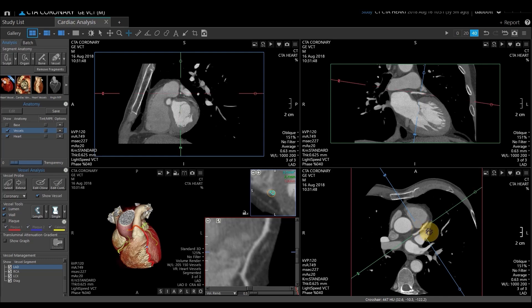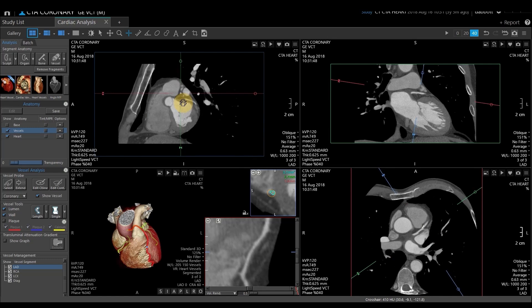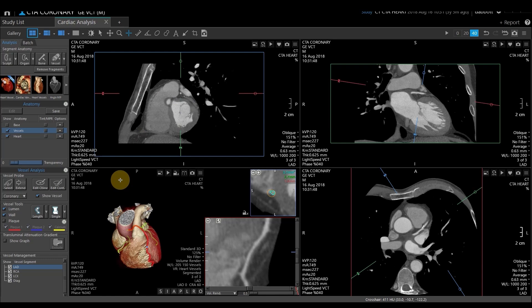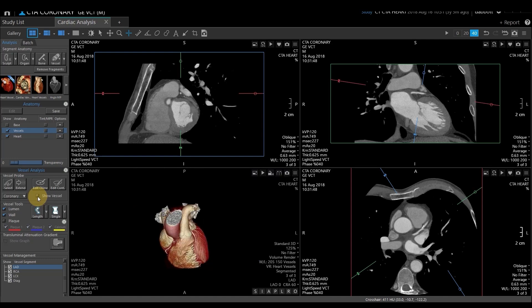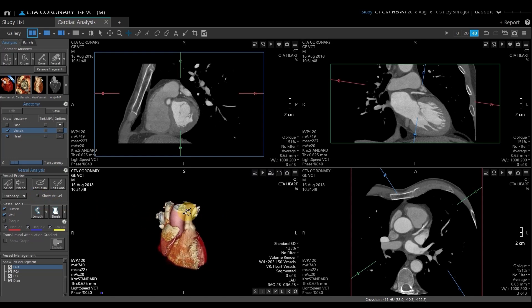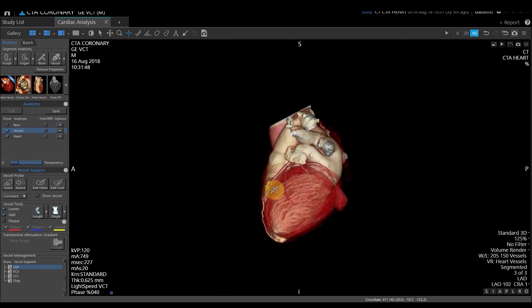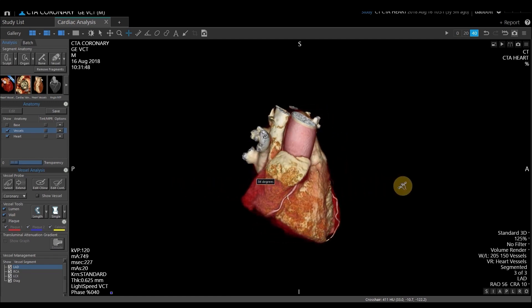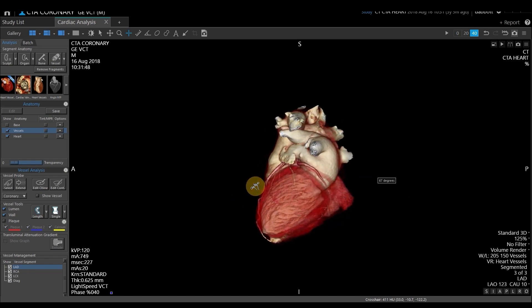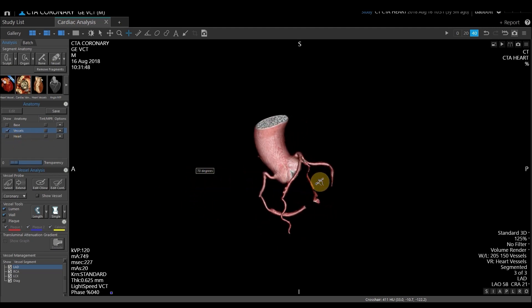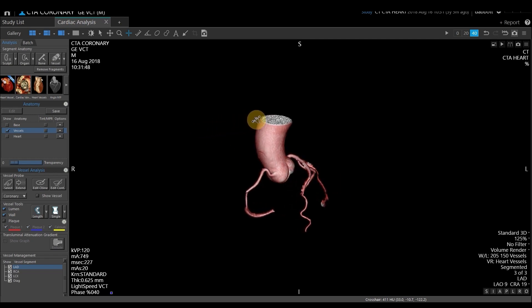If you're done with your vessel analysis and want just a good 3D overview, I would select to turn off Show Vessel. That gives me just a 3D image. I'm going to go full screen, right-click, and rotate to let you investigate our 3D heart. If the heart is in the way and you only want to see the vessels that have been preselected, uncheck Heart under the Anatomy Management file. This will give us just the vessels that have been selected.